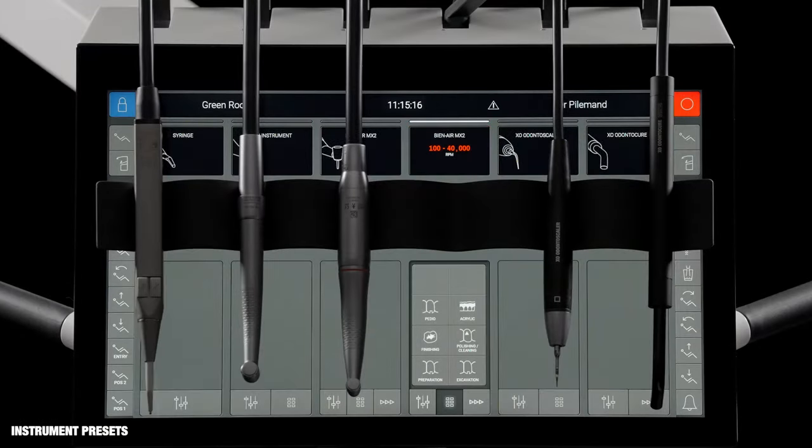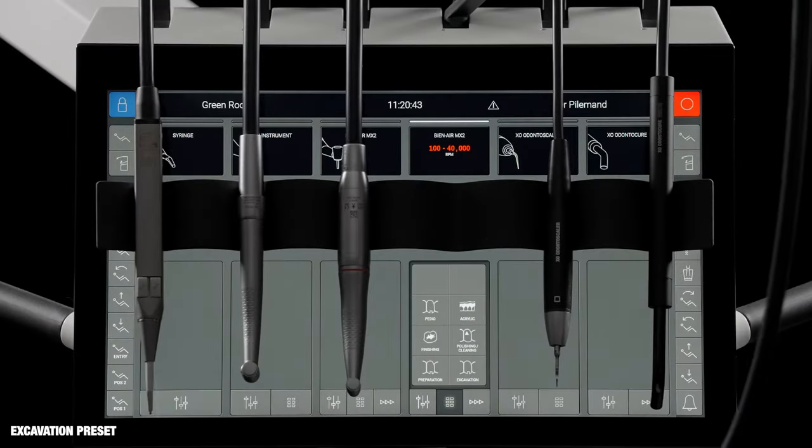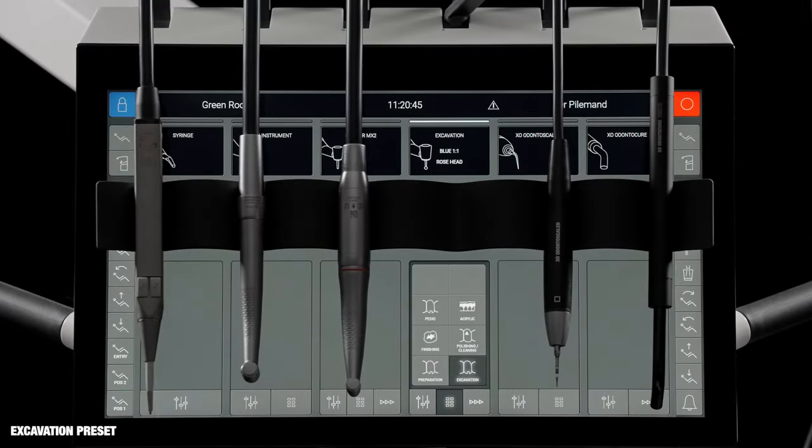A unique feature of ExoFlow is the option to work with instrument presets, where all instrument settings are optimized for performing one specific task. Each user may work with the standard presets that come with the unit or create his or her own presets. When the excavation preset is activated, the micromotor is set up for excavating decayed dentine.